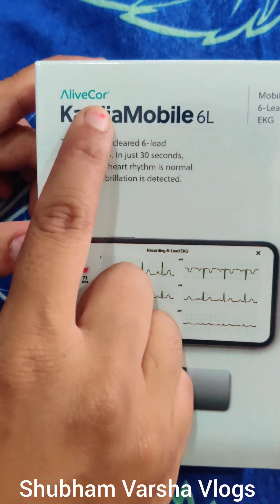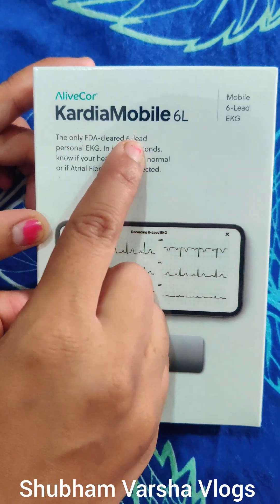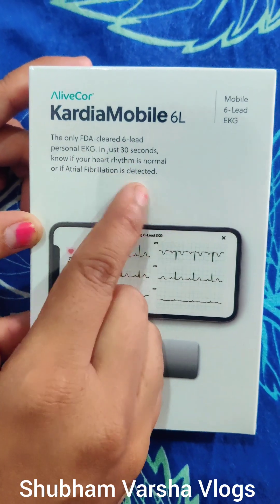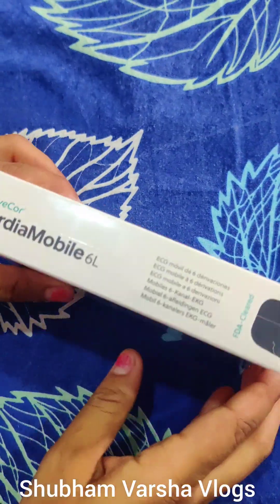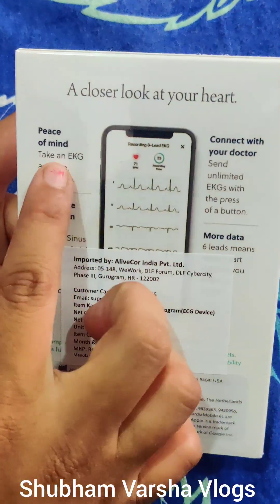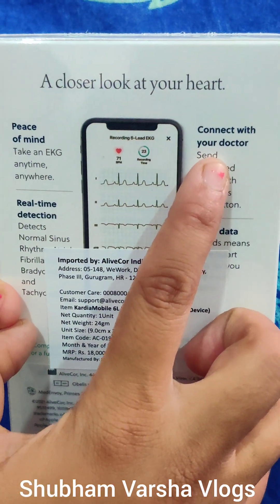Hello friends, in today's video we are going to unbox this AlliCore Cardio Mobile 6 Lead ECG Machine which gives us ECG in just 30 seconds. It is a 6 lead portable device which gives us peace of mind that we can take an ECG anytime, anywhere.